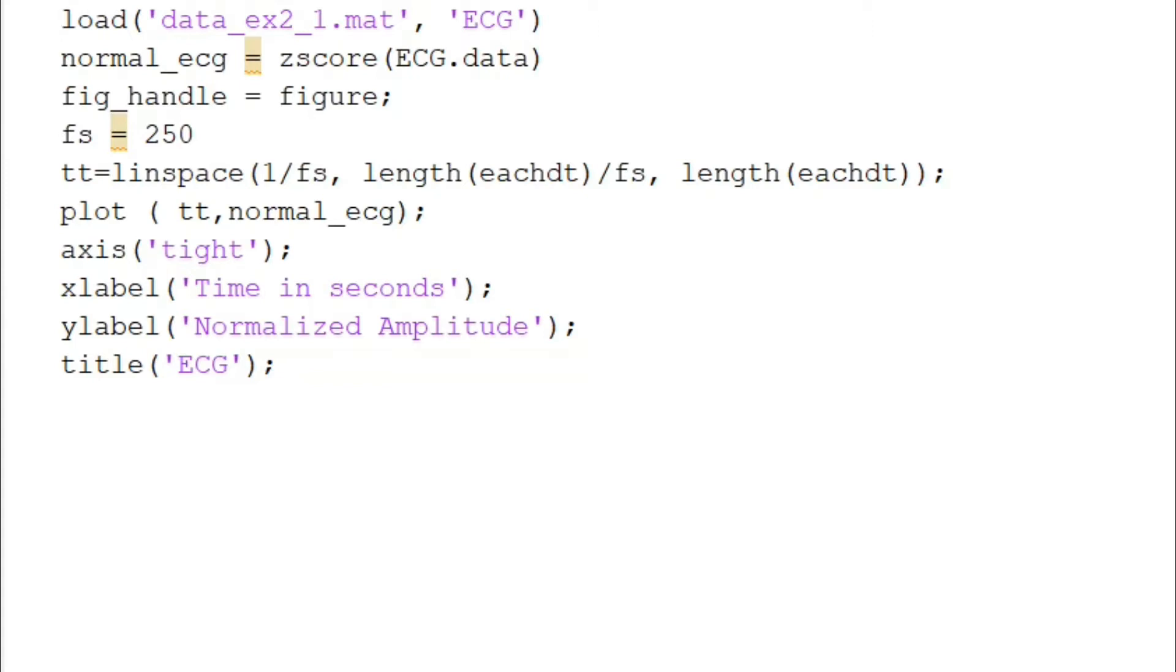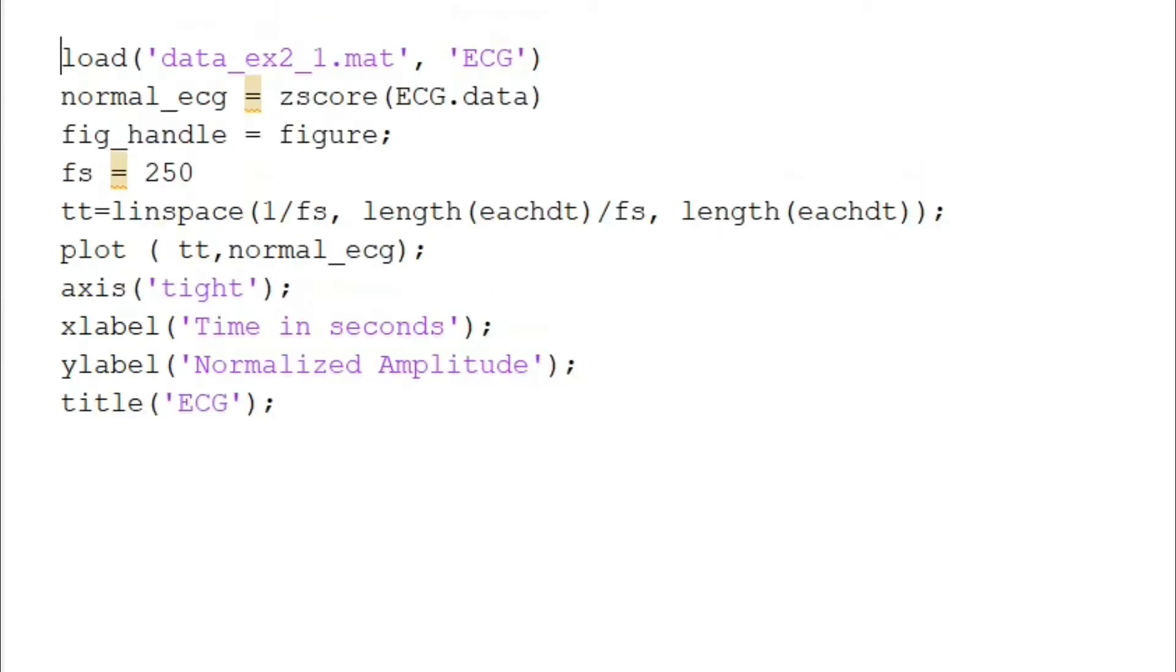So this is basically extracting the ECG signal.